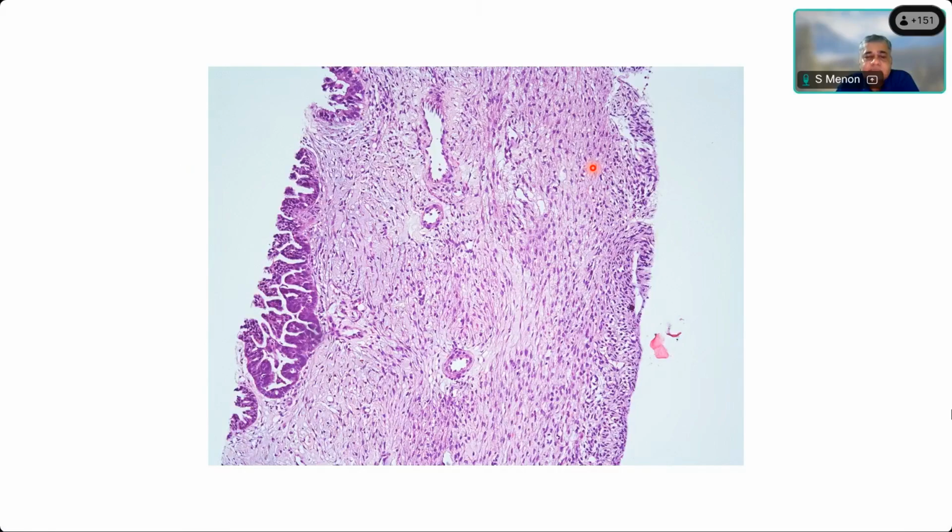Adiba? This is a core biopsy, I think from maybe one of the peritoneal deposits or maybe from the ovary itself, an adnexal mass. Yeah, it looks like an adnexal mass. How do you describe this? Sir, we can see tumor cells are arranged in a micropapillary pattern without fibrovascular cores.